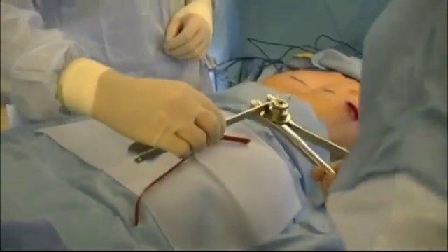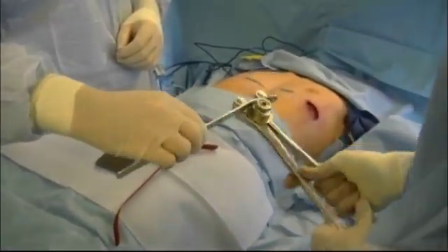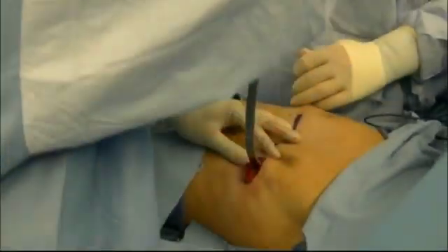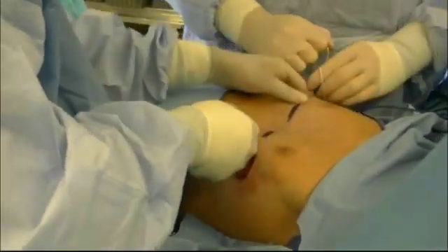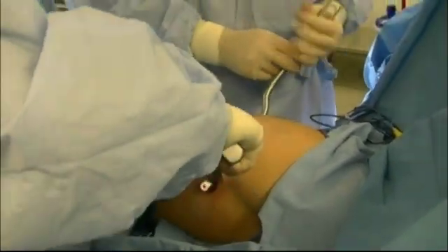We then custom mold a stainless steel bar that fits the patient's exact chest configuration, as seen here. We then pass the custom molded stainless steel bar and then turn it and get immediate sternal improvement.